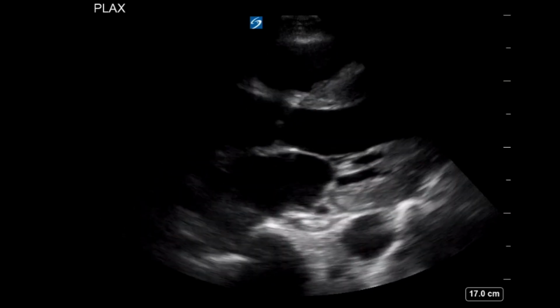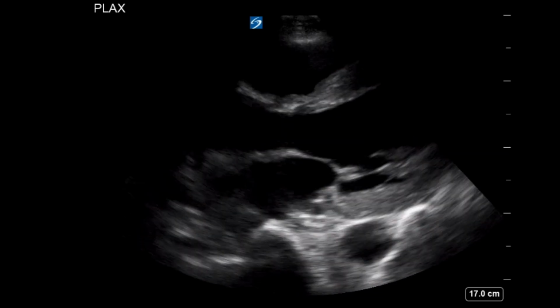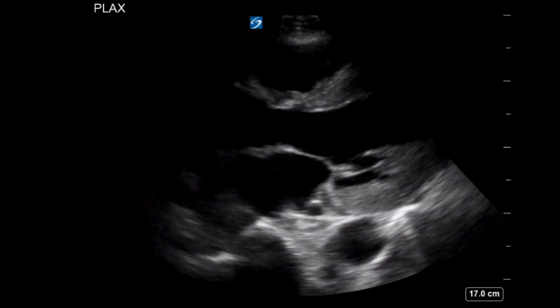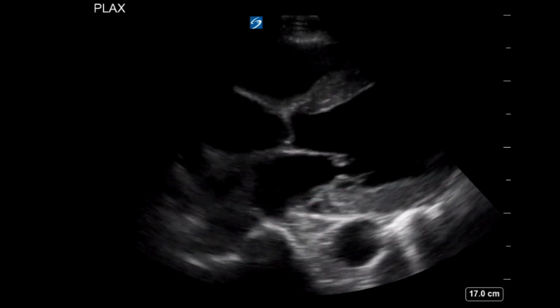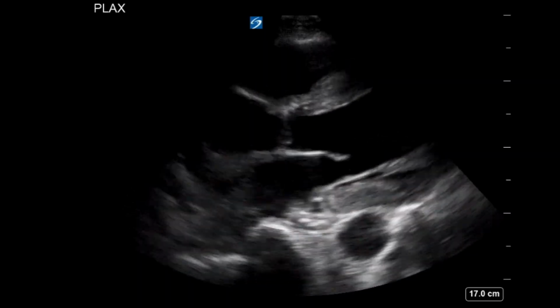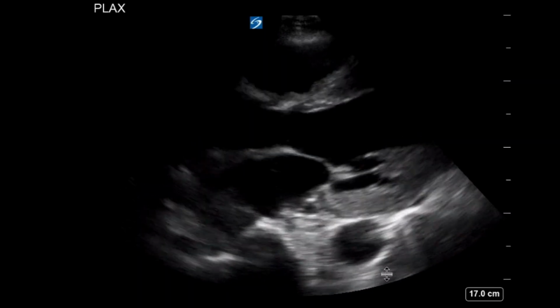Yeah, so this is our first view in the cardiac echo. This is the parasternal long view. So you're using the phased array probe. You have the probe indicator towards the patient's right shoulder, about nipple line, so fourth intercostal space, and you are just left to the sternum. Perfect. Yep.